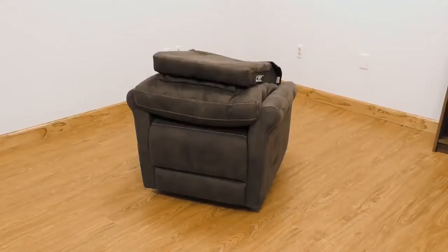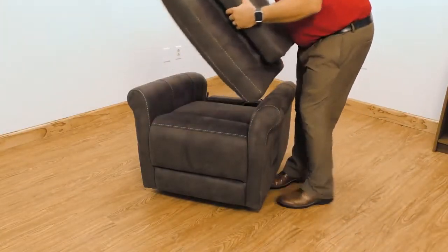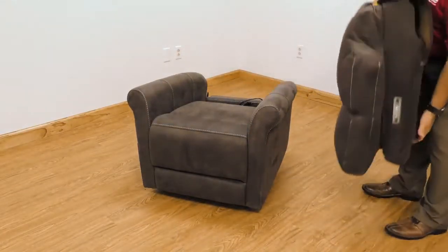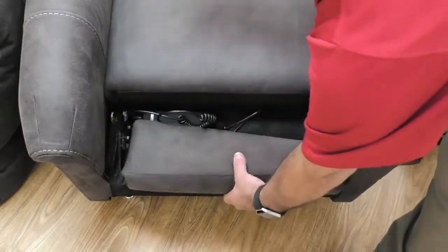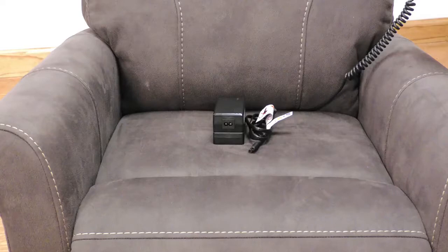Set up for these chairs is quick and easy with our knockdown system. Your chair will have six pieces to assemble: base, backrest, side wings, hand controller, and the all-new lithium-ion battery backup transformer.